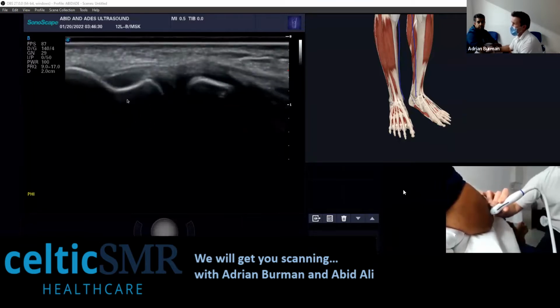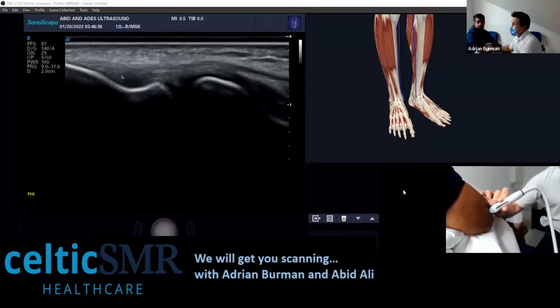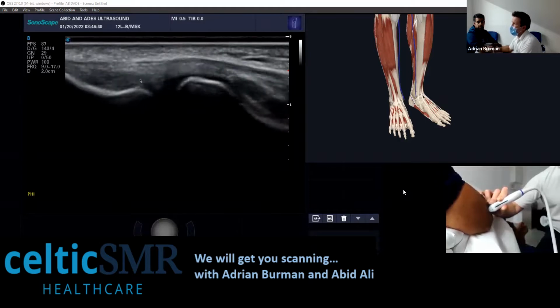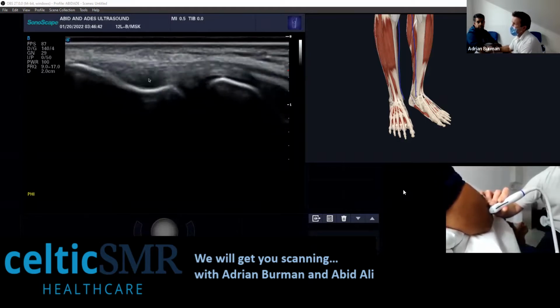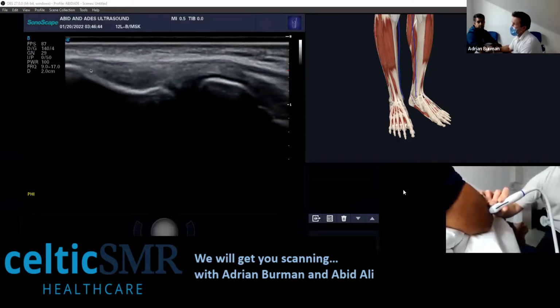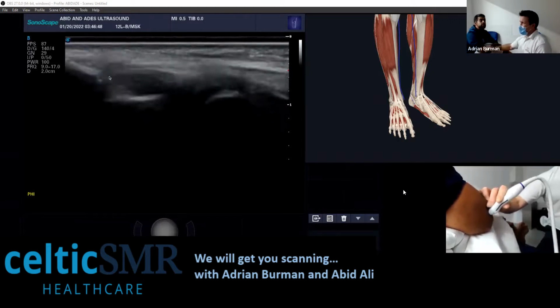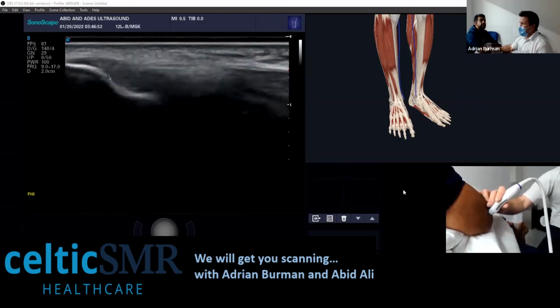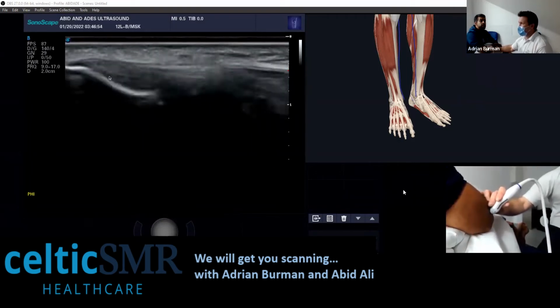I know that right down at the bottom here, that's going to be ligament, because you can see the ligament there. So that much is ligament to about here. If it's 50%, it's going to be up here somewhere with the ligament down here. But I don't tend to report the percentage really, I just give the measurement.